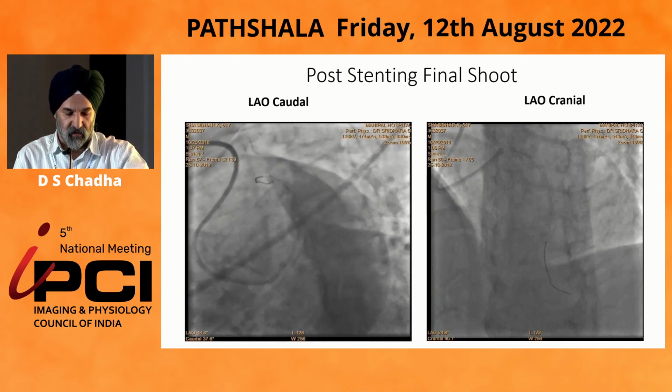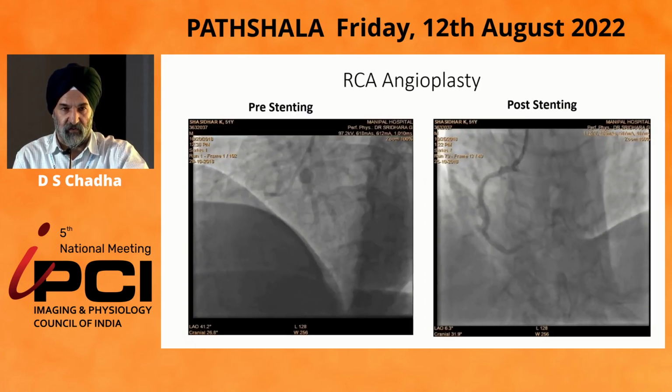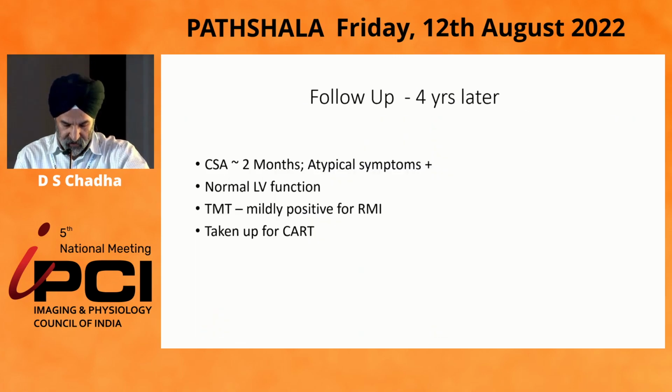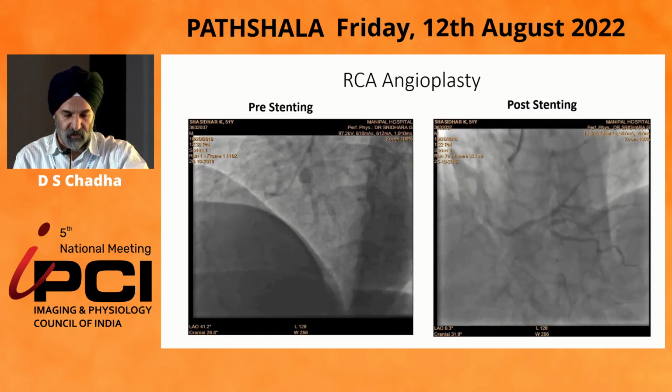Looks good here. The circumflex looks fine. In the LAO cranial view, there appears to be a slight chink there. We went ahead and stented the RCA also, with good results.